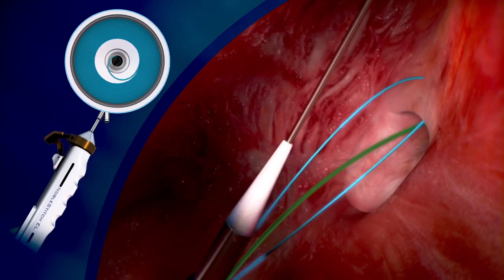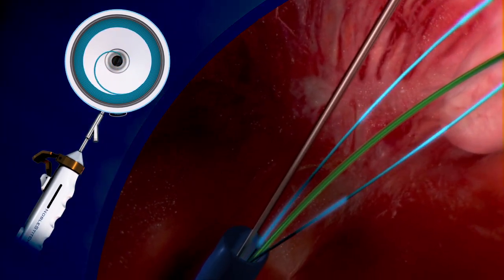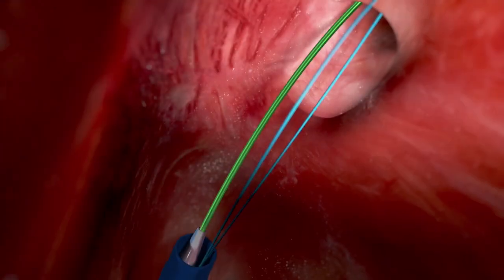The arm is then closed and the device is withdrawn. At this time the 018 wire is withdrawn with the device, leaving the 032 wire in place.